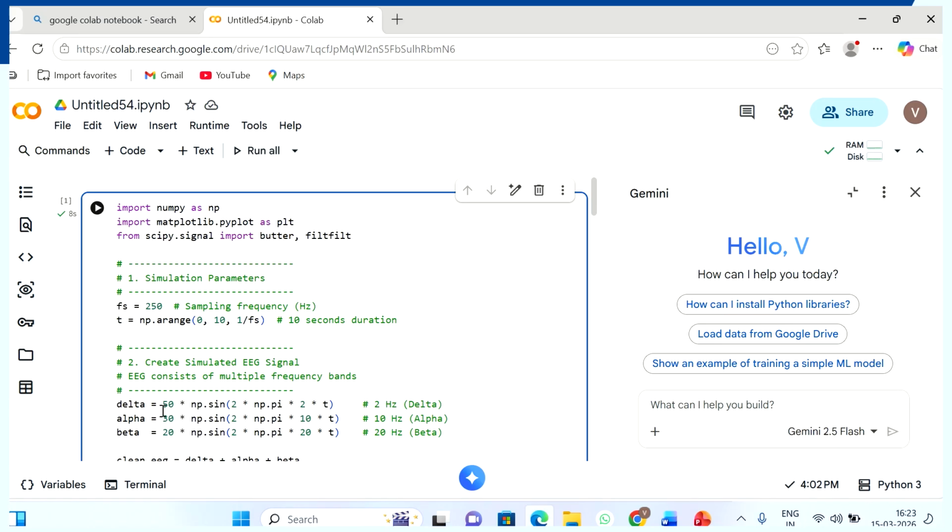The EEG signal contains four waveform components: alpha, beta, delta, theta, but theta is not taken into account because it appears only in infants. So we consider the subject to be an adult. So alpha, beta, delta waveforms we are considering here.